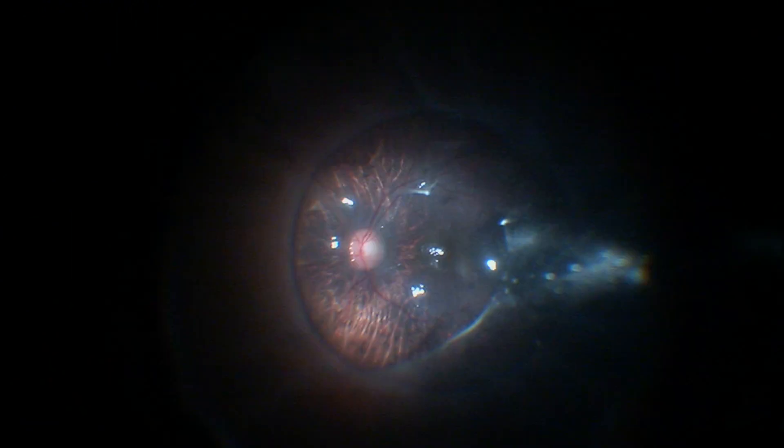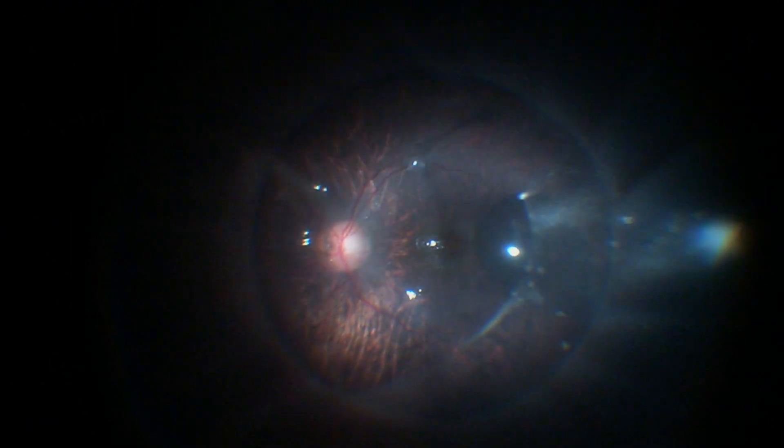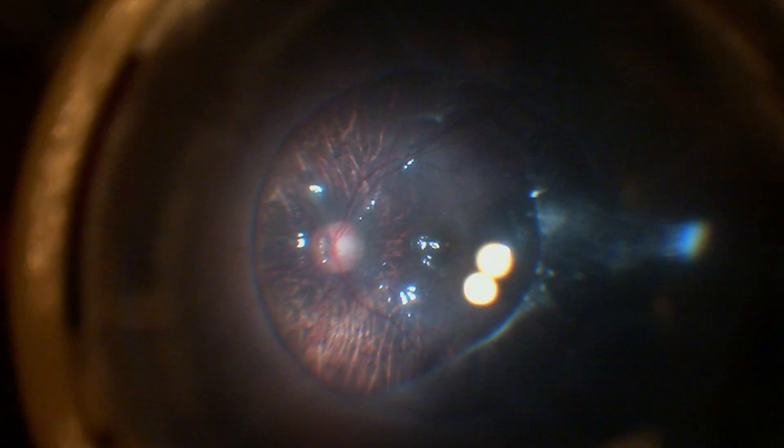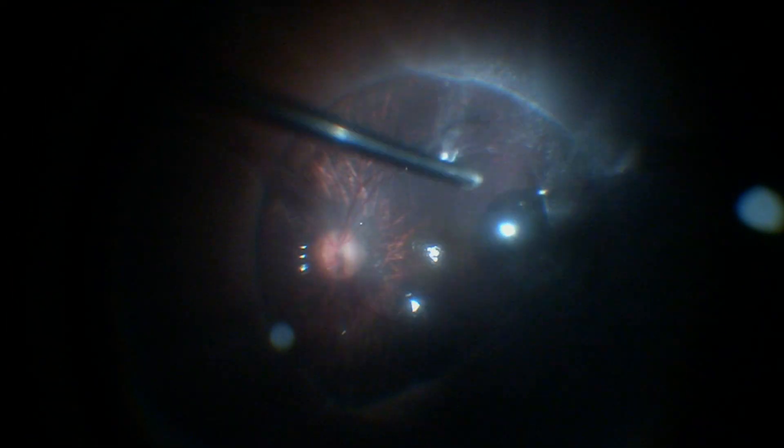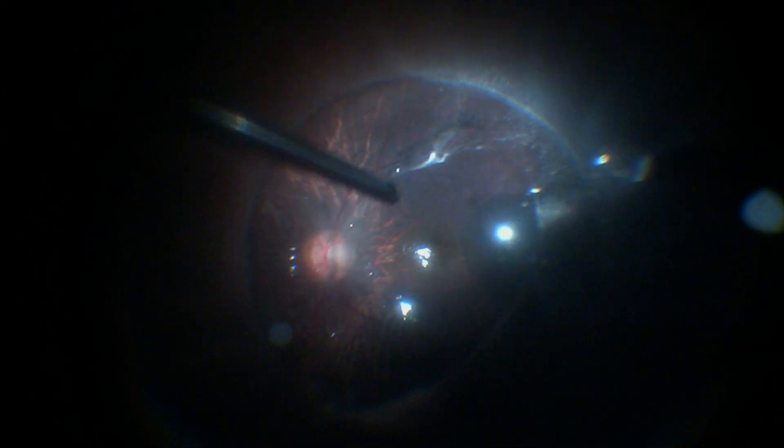The endpoint is at the attachment of the lattices or at the vitreous base.